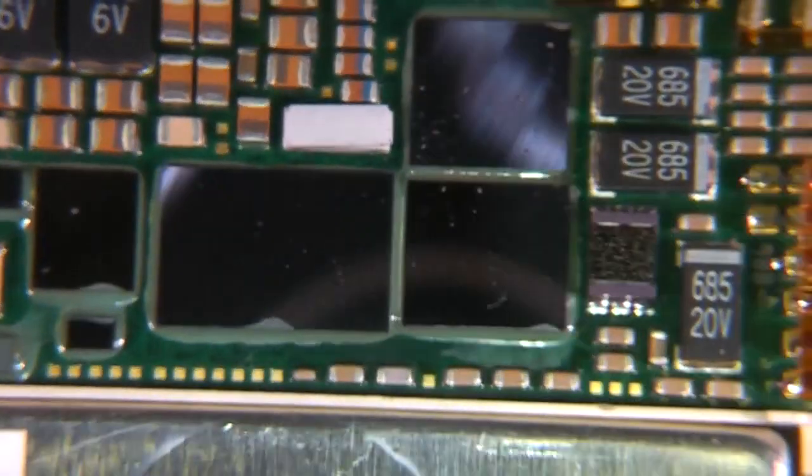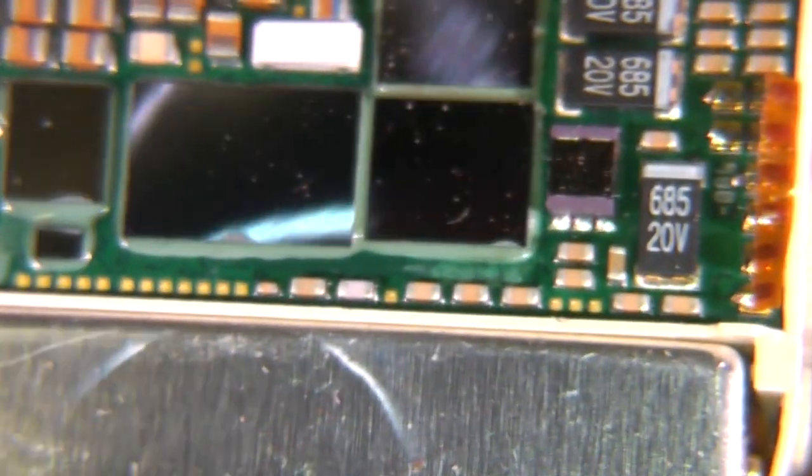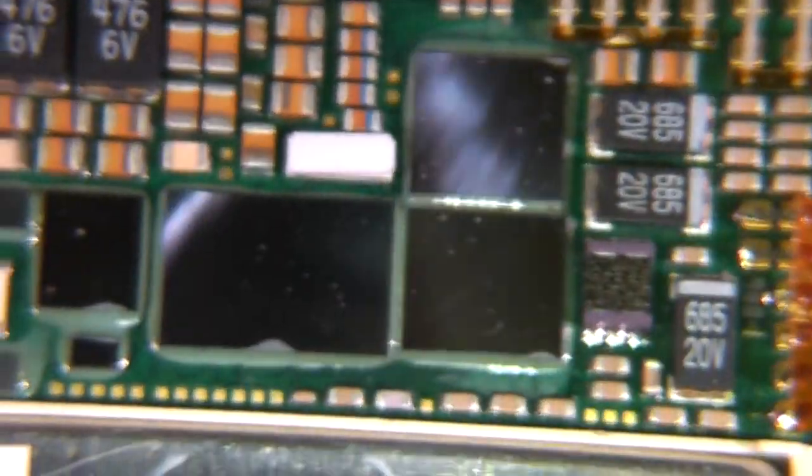For something like this, I'm just curious as to why. I suppose maybe if it's defibrillating, perhaps these are high voltage switching devices or something. But in terms of general processing and so on, those are absolutely huge.